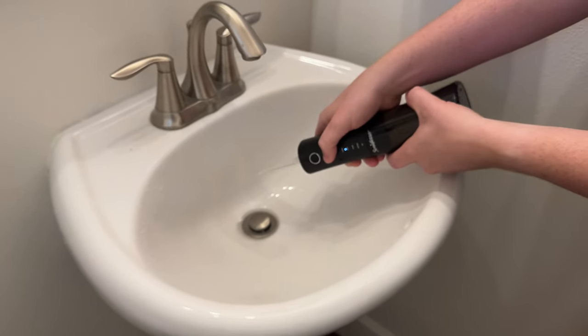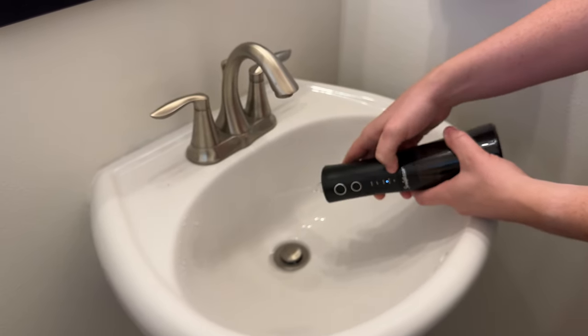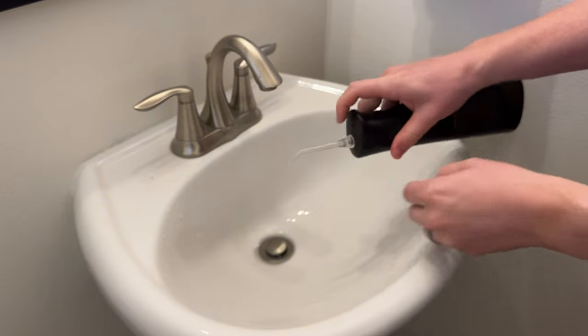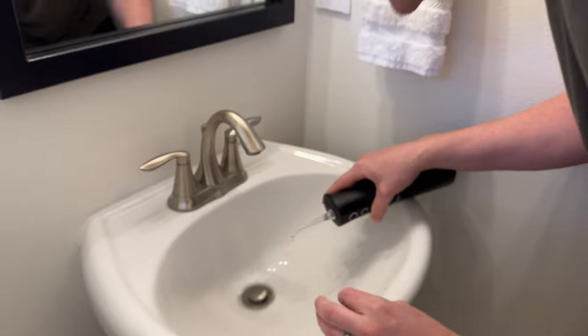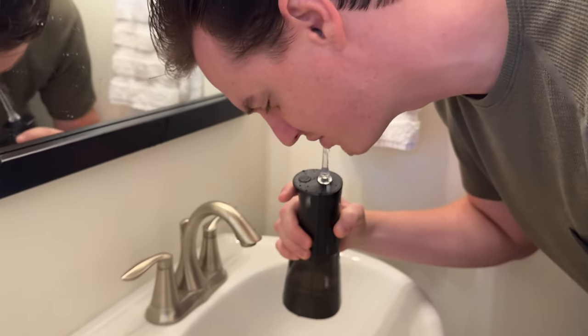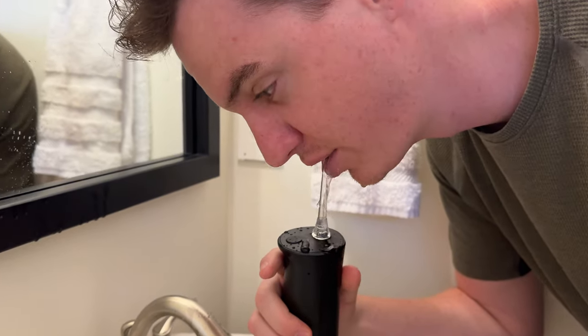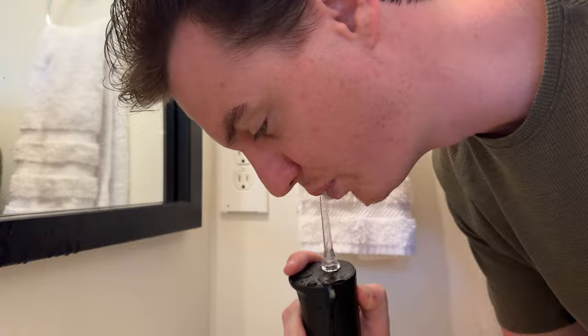So these are the modes to adjust — if you want pulse, a custom mode, or clean which is high power. And then this is your button at the top to rotate the nozzle. Now I'll put it in my mouth and show you how it works — just like this, and it allows you to floss with water really well and cleans out your teeth.